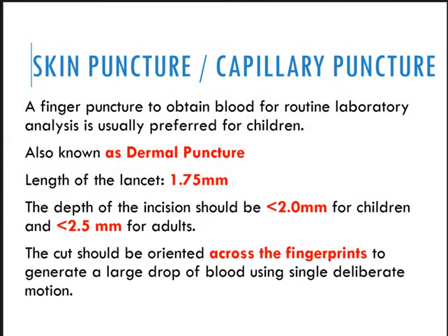Skin puncture, or it's also known as your capillary puncture. It is a finger puncture to obtain blood for routine laboratory analysis, and it is usually preferred for children, okay? Because number one, children, they tend to throw tantrums at you, mahadlok sila mulantaw og syringe. They have, or parents usually have a toxic trait na muingon sa ilahang mga kids na like super daghan kaayo ato ang kwaon na dugo, which is incorrect, guys. Please educate your children well for the future generations, okay?